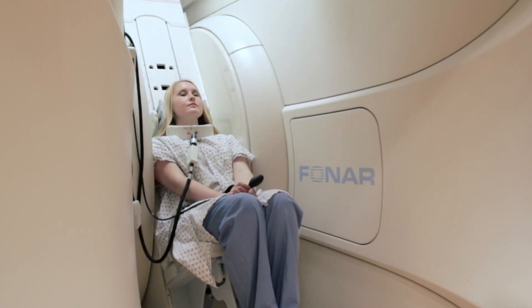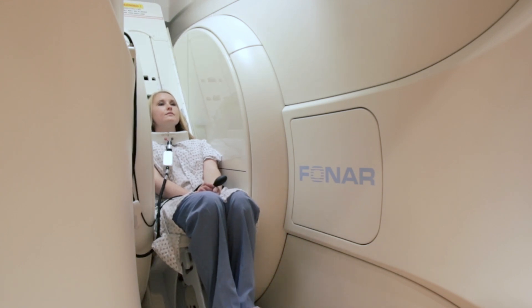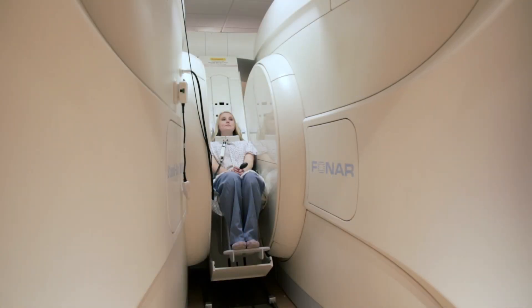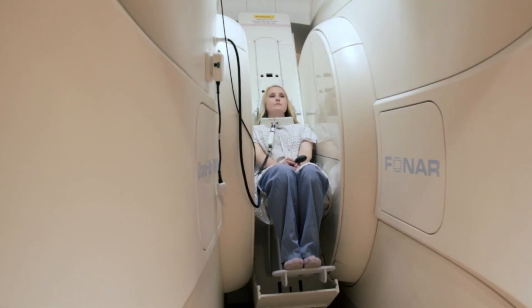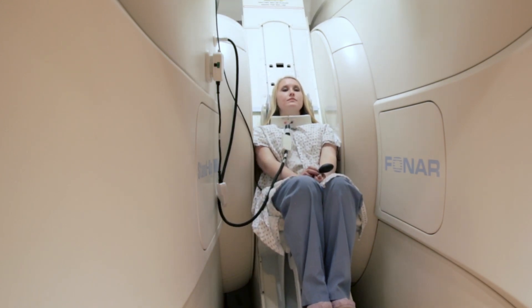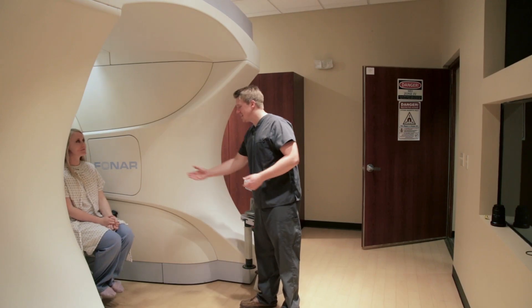We also have the lumbar flexion and extension sequences. With those, we would have you actually bend as much as you can with your lower back, and then have you in an extension position where you try to push your stomach outward. We see a lot of patients that have tried other places and feel like there's no hope for them to have an MRI. They come to us, they have it on the upright, and they walk out with a smile on their face.